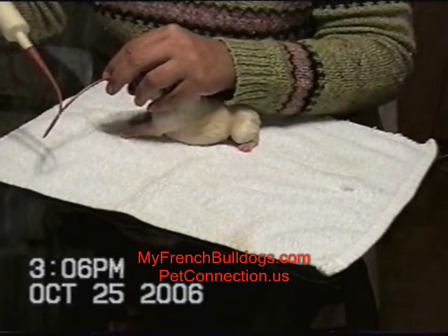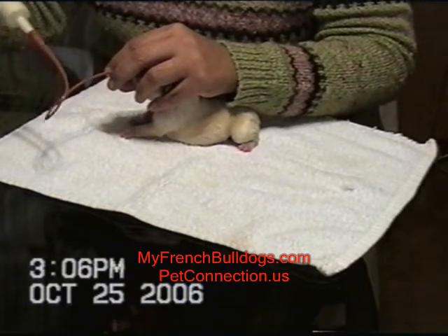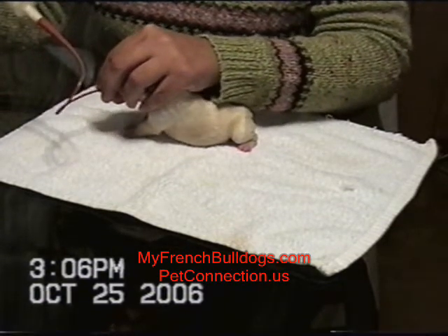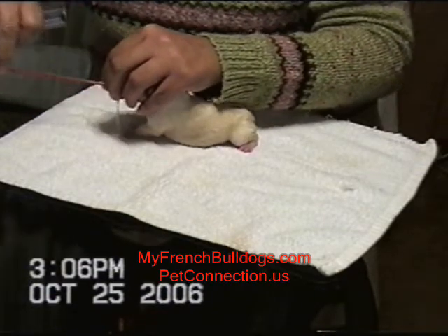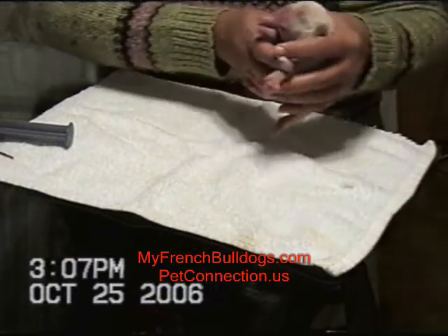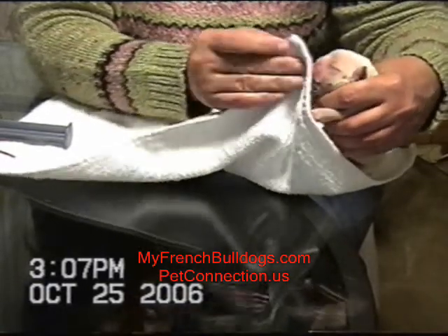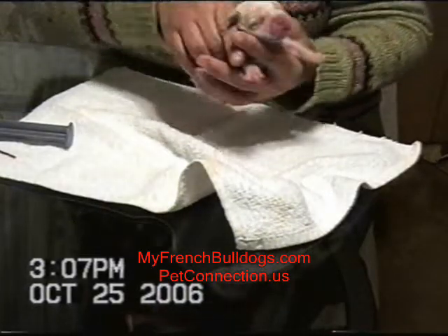Very slowly inject exactly what you want to put into this puppy. In this case, if he weighed 10 ounces, we would be giving him 5 cc's 8 times a day, or every 3 hours. You want to do it very slowly so that you don't blow milk into the stomach. Sometimes that'll make them blow it out the nose, or a little extra might come up at the mouth. A lot of times it'll come up through the mouth a little bit anyway. When you start to pull that tube up, the milk will follow. I usually dab off that little bit.